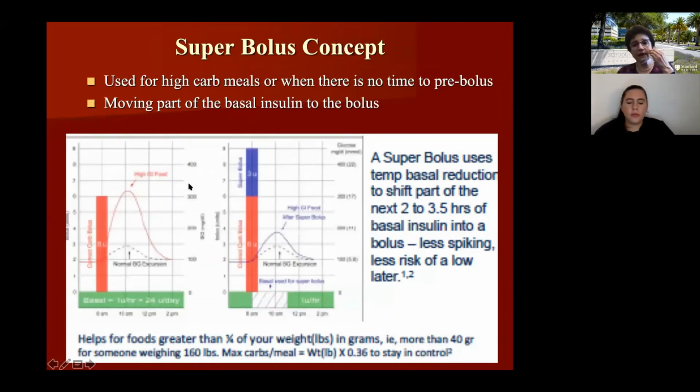So there was a question from Dr. Basina. Yeah. So what does it mean if your basal/bolus is 20%, not 50%?